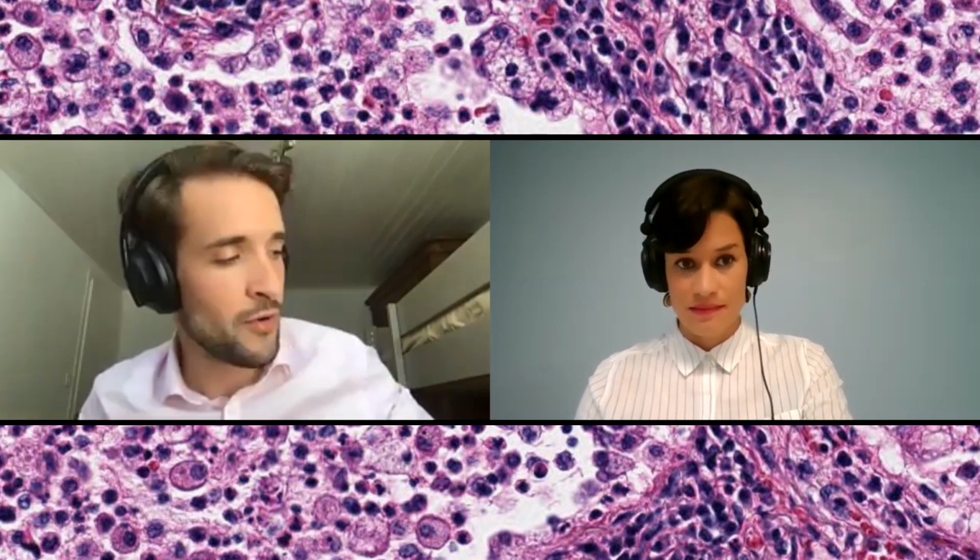So we have trained three different markers to date, as I said. Two of them are in advanced stages, the CD3 and the epithelial markers, and then we also have DAPI, which is just being finalized at the moment. When we finished training those models, we assessed the performance by comparing the virtually stained image back to the ground truth, and we looked at the correlation between both images.